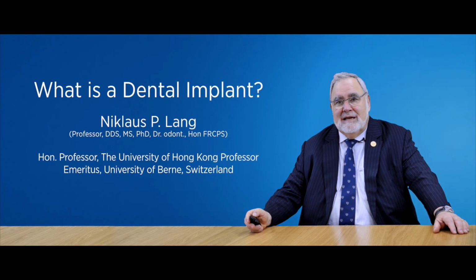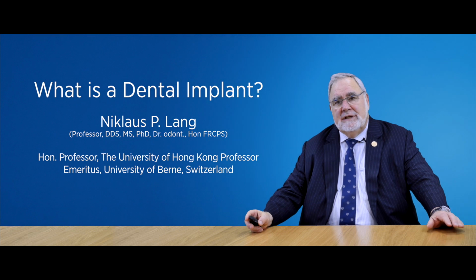What is a dental implant? A dental implant is a device that is installed into the jawbone to retain a prosthesis in an edentulous patient.